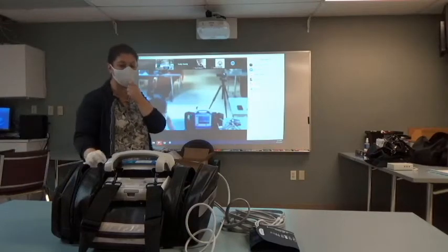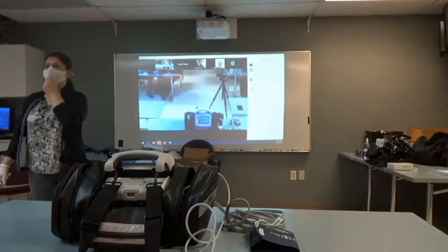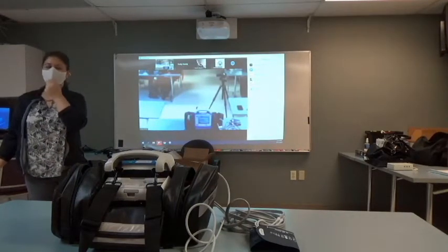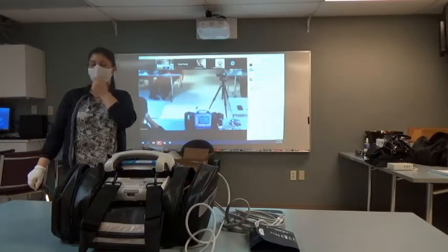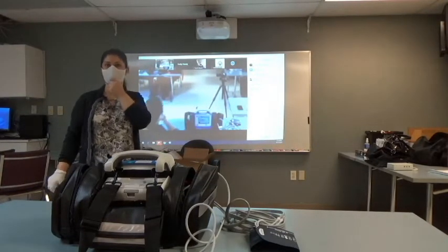Let's go over to NIBP. Press the enter key. You'll get a menu. Use your navigation keys to go to NIBP mode. Press enter. Use your arrow to find the word auto. Press enter.